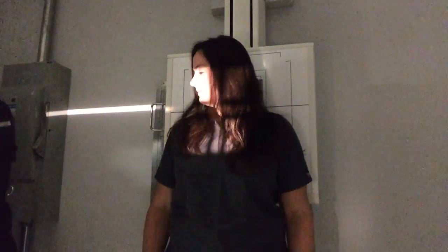We're going to put a 15 degree angle on our tube. Make sure that you don't have your light on when you put the angle in the tube so you don't blind your patient. Then line everything up. Shield your patient — you're going to use a lap apron for this one. You don't want to use the full body apron because it will show up in your image if it goes over the shoulders. You can also use a thyroid shield.